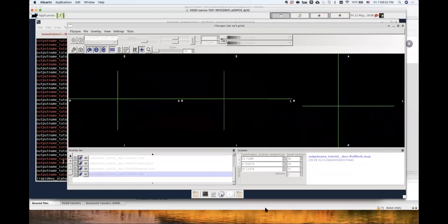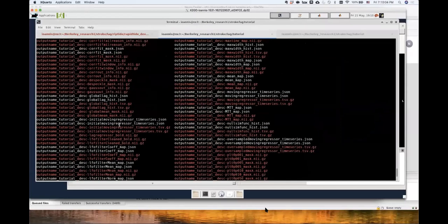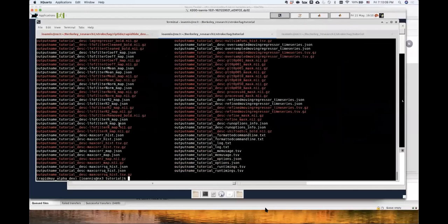Okay, so I've shown you a bunch of maps that are basically NIfTI files that live within that folder. And those are not the only ones. You can find a lot of different maps that can be of potential interest for your specific study. One nice way to look at them in a more comprehensive way is to invoke RapidTide's graphic tool, which is called Tidepool.